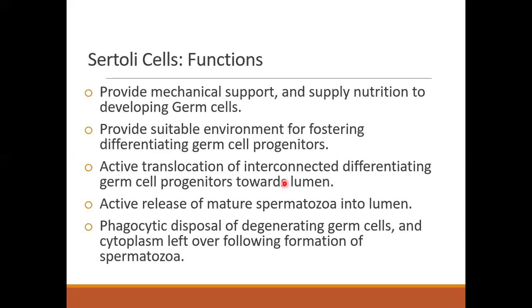In fact, it will cause sterility because the sperms must be functional. And what happens is that as we move along, you're going to get into a situation where we get sperm aggregates. How do the sperm get aggregated? It means that there's some immune effect somewhere. So if you do see a lot of clumps, the sperm cells clumping, then there's some aggregation. And you know that aggregation can only happen once there is an antigen-antibody reaction. So it tells you that potentially there is an anti-sperm antibody somewhere.